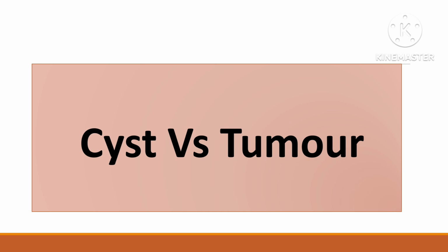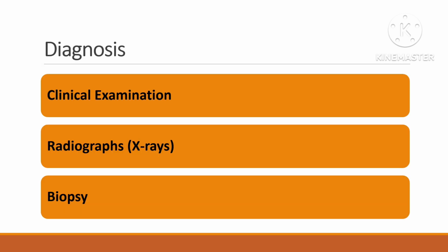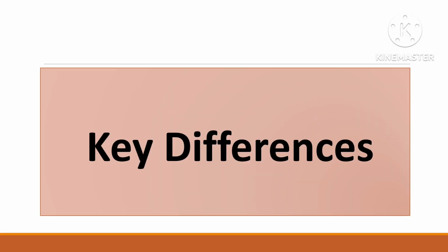A diagnosis of both these lesions can be made on the basis of clinical examination, radiographs and biopsy, where a tissue sample is taken for histopathological examination to confirm whether the lesion is benign or malignant.